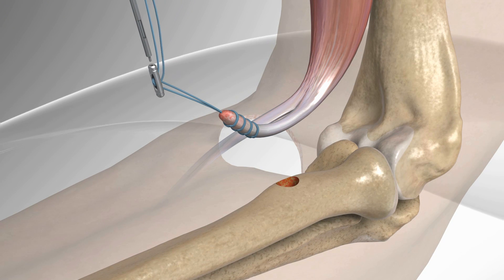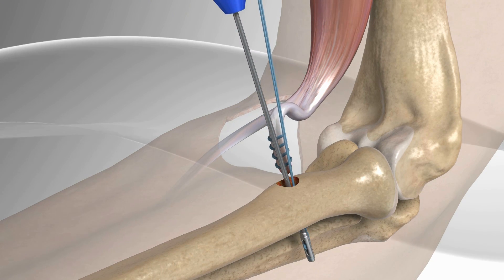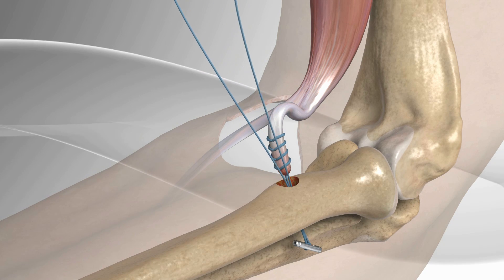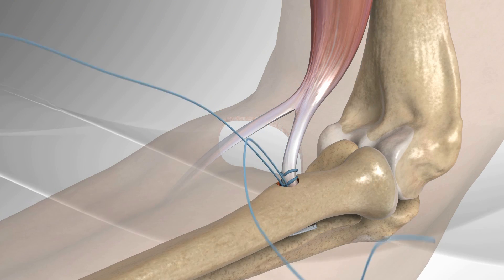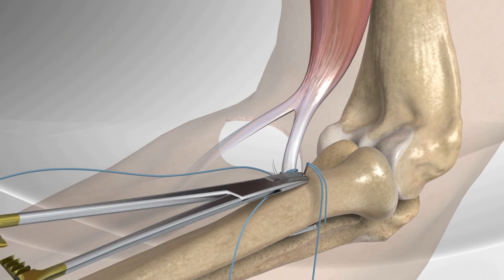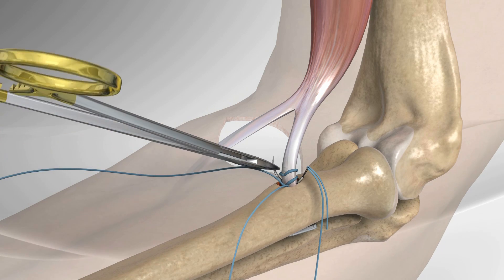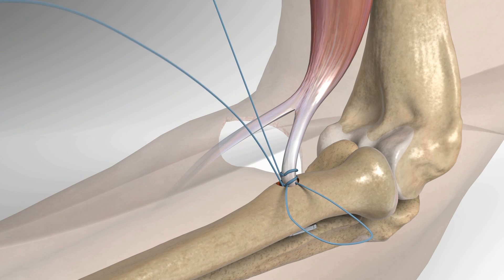The button is then passed through the socket and comes out the opposite end of the tunnel. The suture strands are pulled to dock the tendon in the base of the tunnel. Once the tendon is fully seated, a free needle is used to pass one limb of the suture strands through the tendon and tie a knot.